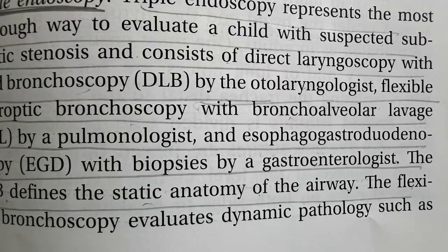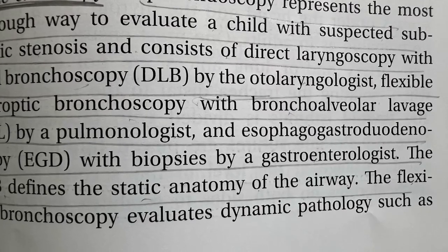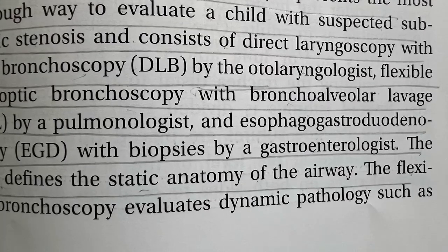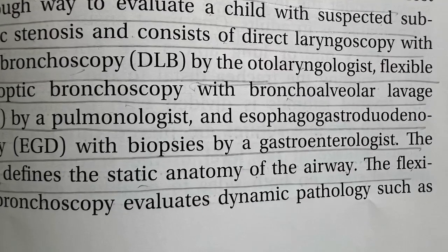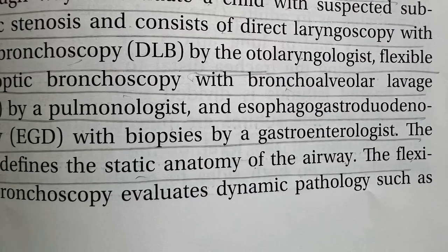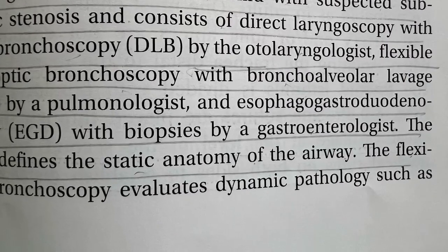So, in summary, triple endoscopy has DLB that defines static airway structure, flexible bronchoscopy that defines dynamic pathologies, and EGD that defines the gastroesophageal factor contributing to airway disease.